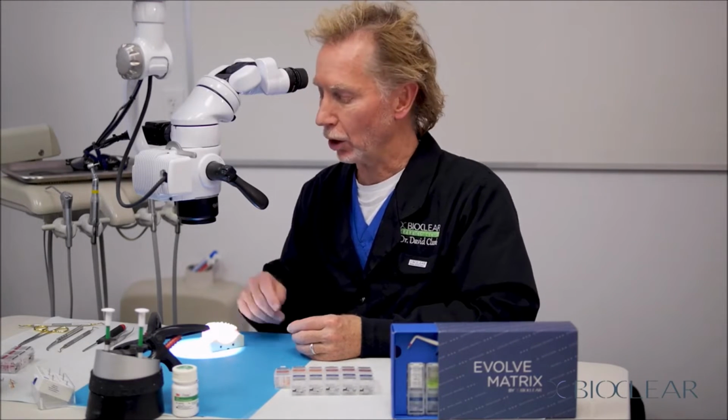So in a young patient, it's going to be 4 plus 1. So if the cavity is 4 millimeters deep, we'll add 1 millimeter and we'll pick a 5 millimeter matrix. But for most of the patients in my practice that are adults, it's going to be 4 plus 2 equals 6. So let's pretend that this is an adult patient. The cavity prep is 4. We measured it at 4. Now I'm going to grab a 6 millimeter matrix.